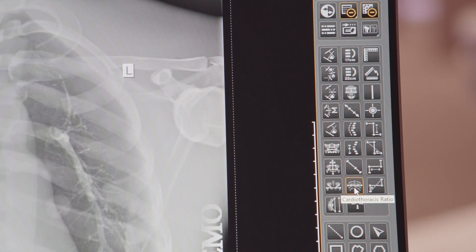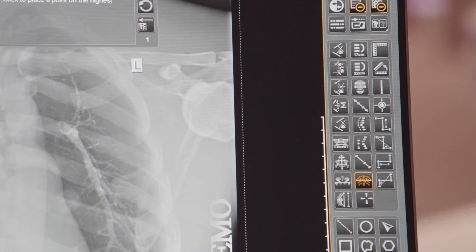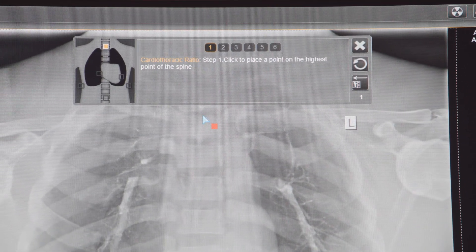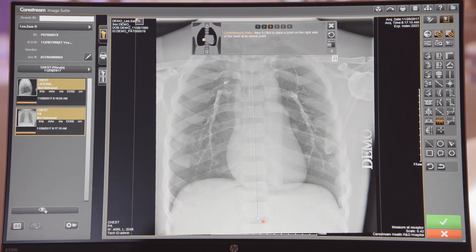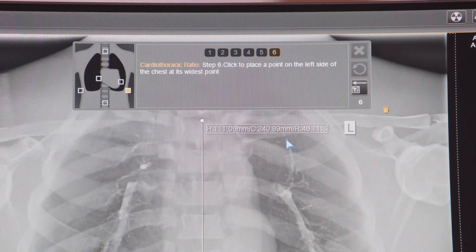ImageSuite offers advanced tools for different measurements. Each of these advanced tools provides online help to walk you through performing the measurement. Once you're complete, the measurement calculates and displays on the screen.